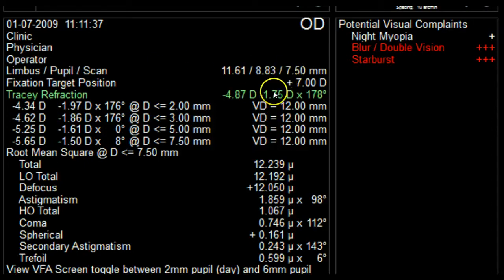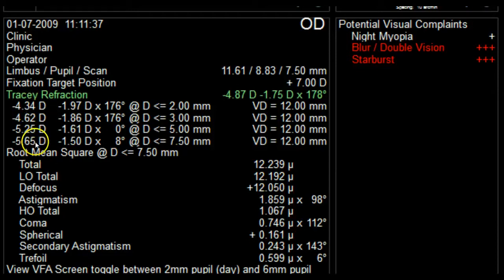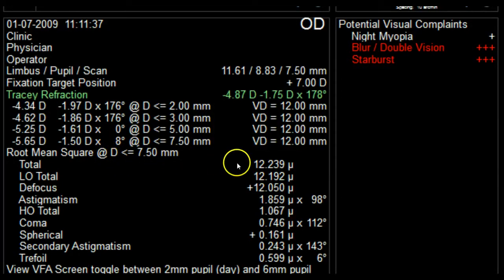The refraction information is next, with the green numbers showing the simulated autorefraction taken at 4 millimeters. The box also displays the refraction information zonally at user-defined intervals. A quick check of this information reveals that the patient's refraction changes by over one diopter as the pupil expands. The next set of data are the RMS values, which we described in previous webcasts. And lastly, it also displays any notes recorded for this exam.